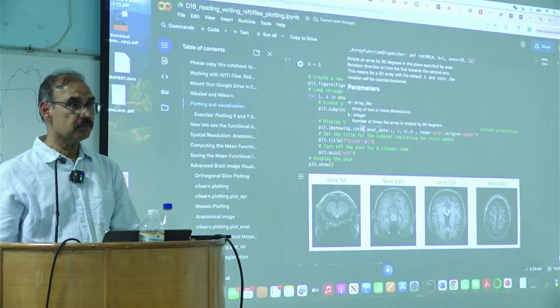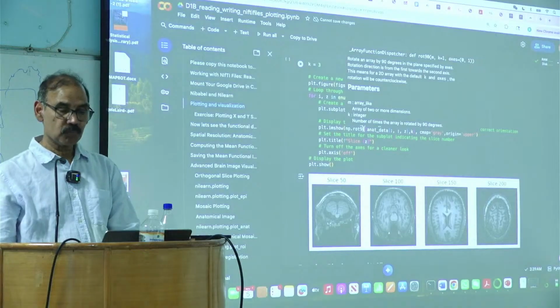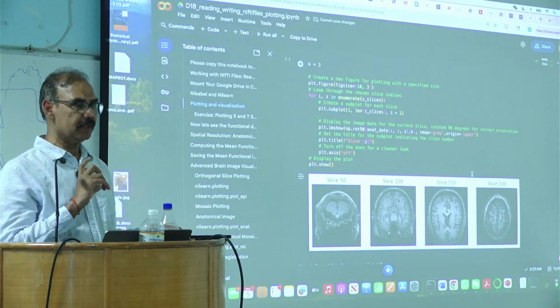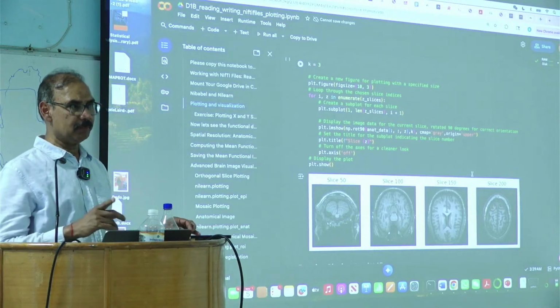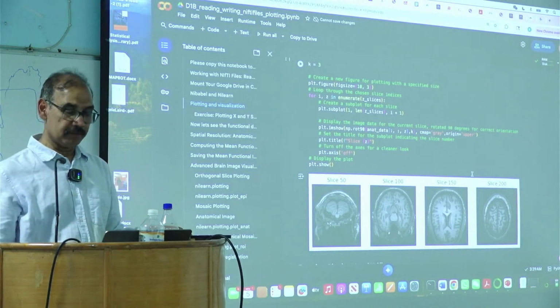But did anyone try like 135? I think the trouble with rotating it at an angle other than multiples of 90 is that the matrix dimension changes, right? So you have to correct for that, okay?